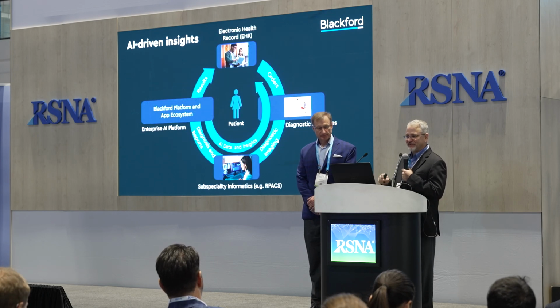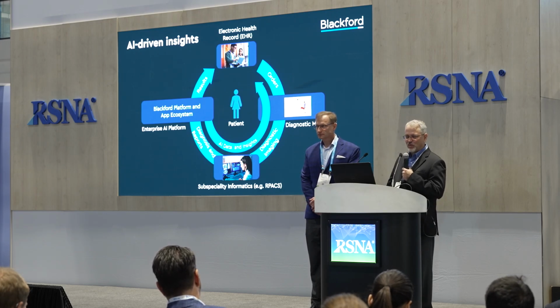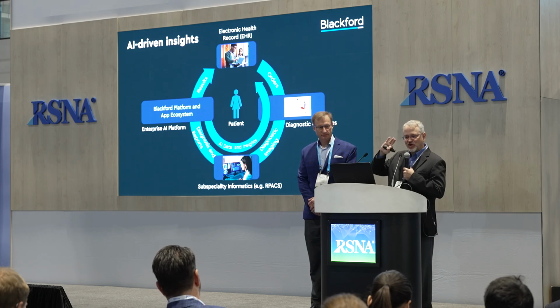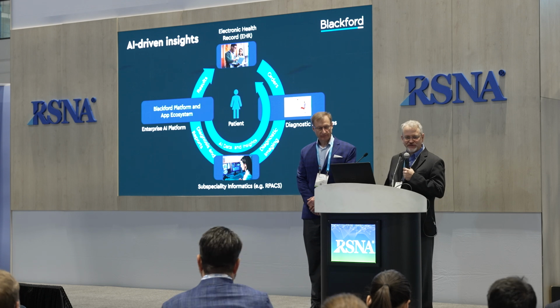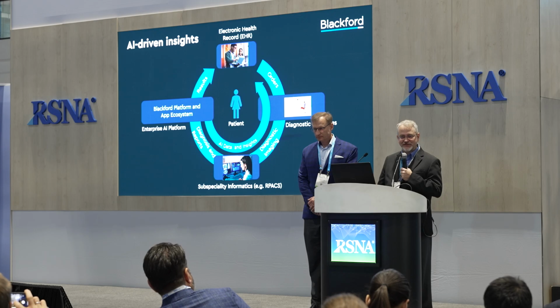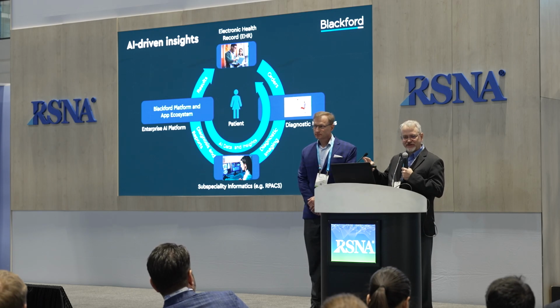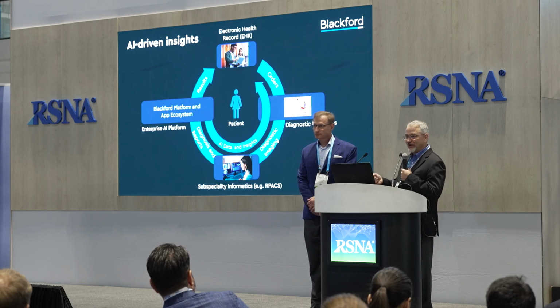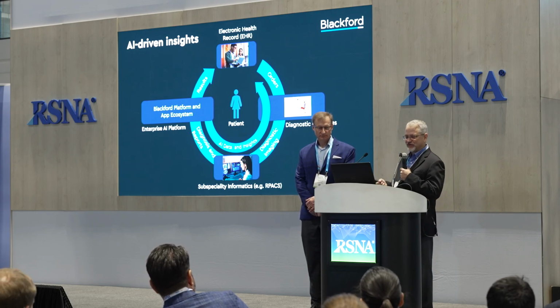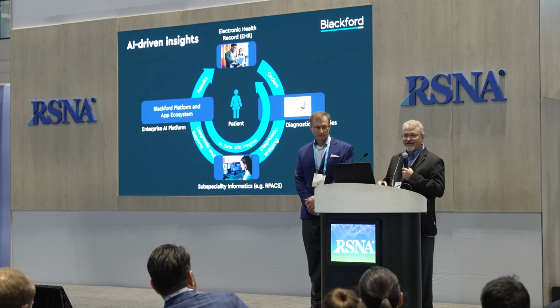So most organizations have this view of the world. When you start to think about the pie-in-the-sky view of how AI will work, you can see this concept of data flowing from the EHRs, or electronic medical record systems, orders and information flowing to the modalities automatically, that imaging data then flowing to the informatics systems, whether radiology or other informatics systems, diagnostic information and reporting information flowing to platforms, the right AI module launching at the right time for the right type of patient, and then all that AI-based data, new data potentially from AI, flowing naturally back to systems of record, right? So that's the high-level overview.